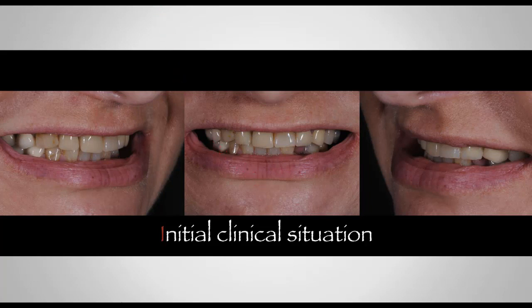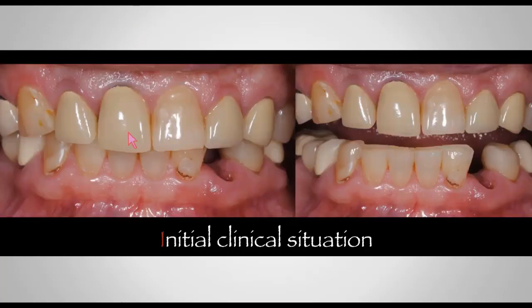So this is the preoperative view of the patient. You can see she was missing one of the mandibular incisors. She had a combination of natural teeth with a lot of PFM crowns, and that's what you're seeing right here. So this was challenging because we had to bond to these PFM crowns and to the natural teeth.